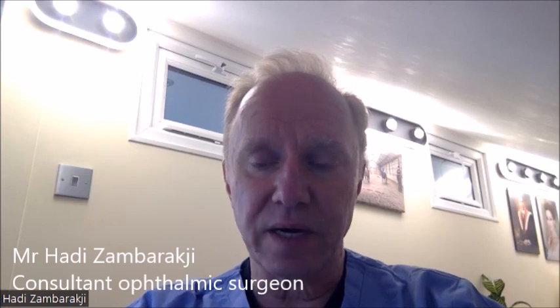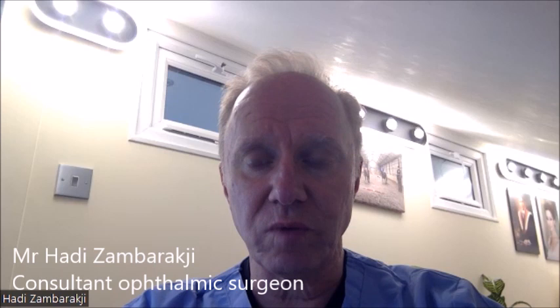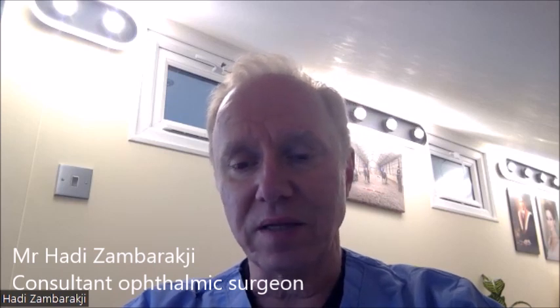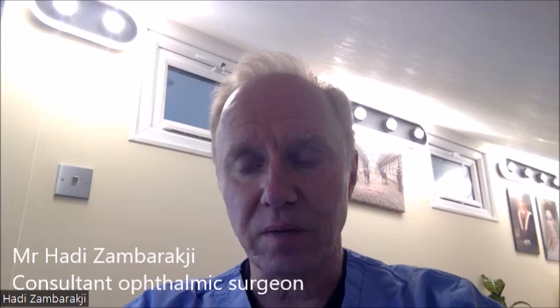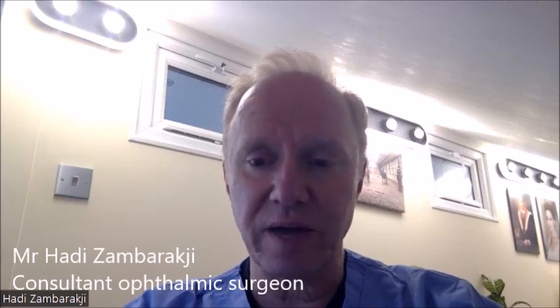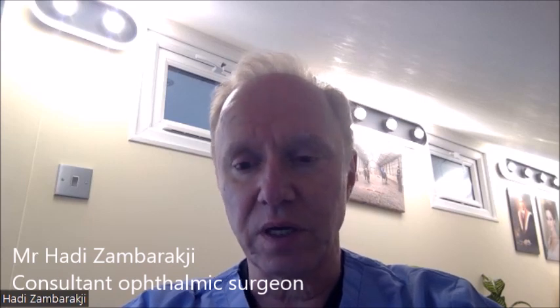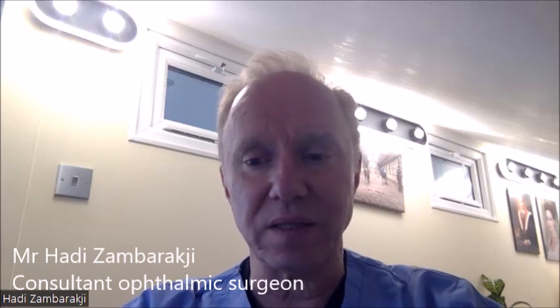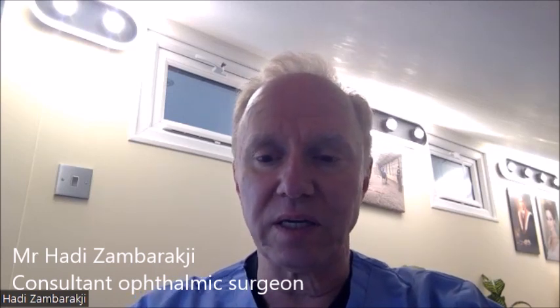The use of enhanced monofocal lenses or monofocal plus lenses at the time of monovision correction has actually been a great advantage, because with enhanced monofocal lenses, it is possible to achieve a fair degree of spectacle independence without creating a big offset.